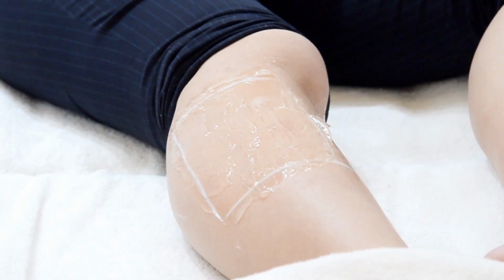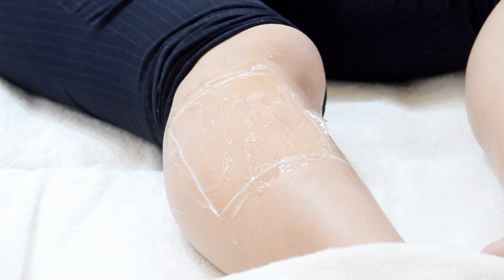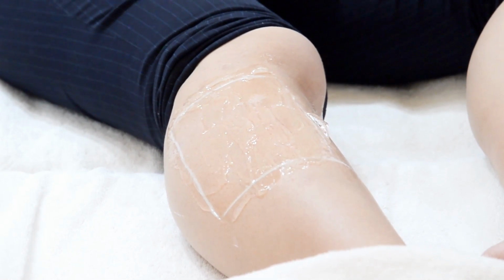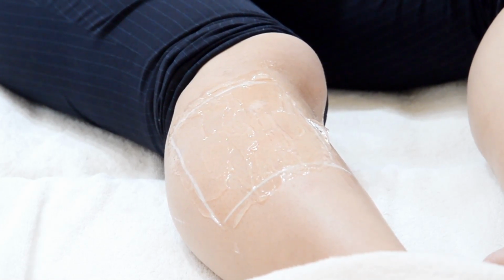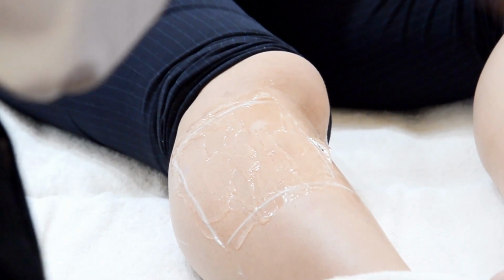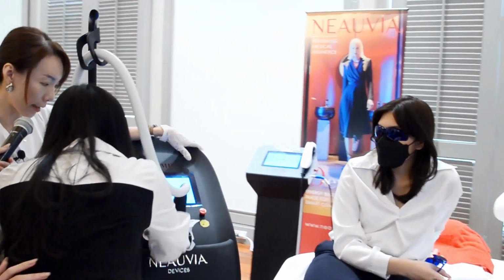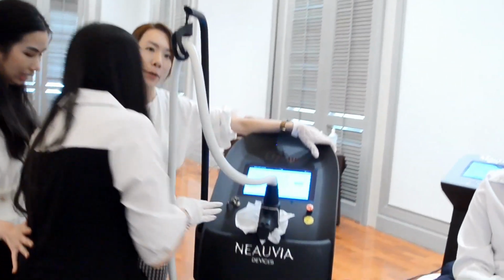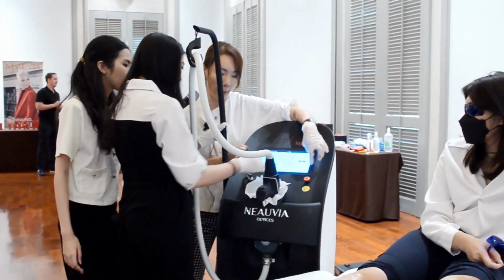Okay, then you can come over to select the parameters. Come here, get closer. Okay, so you'll use the basic mode. Where are we treating? The lower leg, right? So you choose the lower leg. You want to come here so that it's easier. Female, Chutima, okay? Female is chosen. Next step.